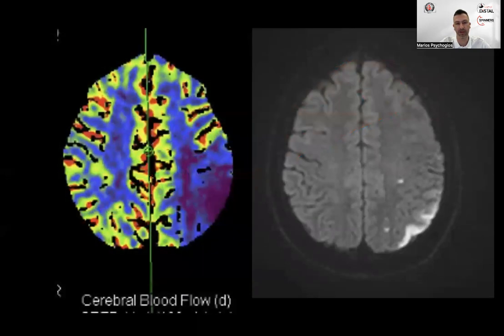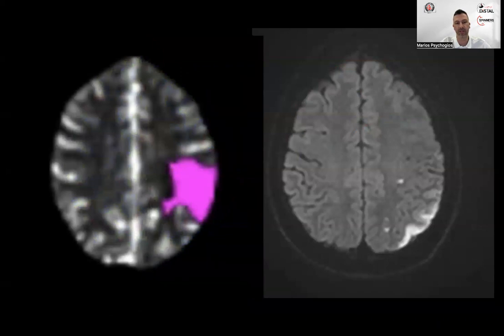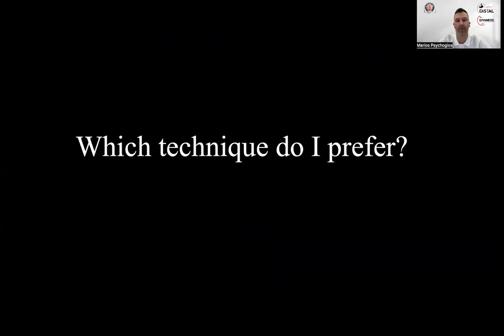Here is a nice comparison, I think, about what could have died if we didn't do anything from brain, and what you see on the DWI as ischemic lesion or as infarction, and also to the point about automated software. I think we have to have new software that is dedicated to MeVO, because at the moment what we see there is not 100% the truth, I find in my experience. So this brings us to the techniques that we are using for MeVOs and for DVOs.